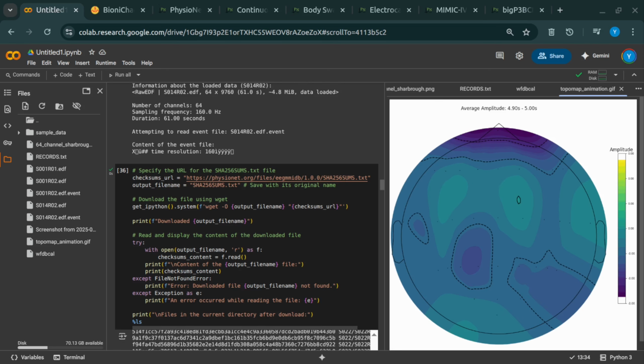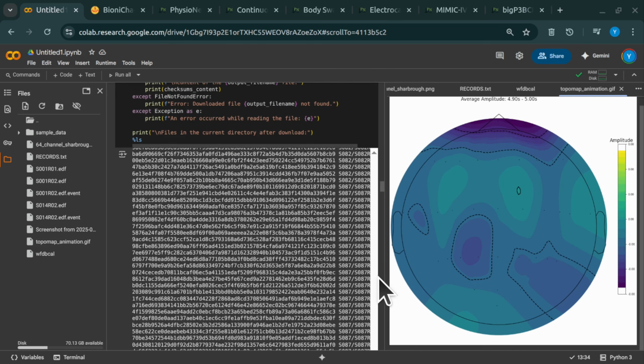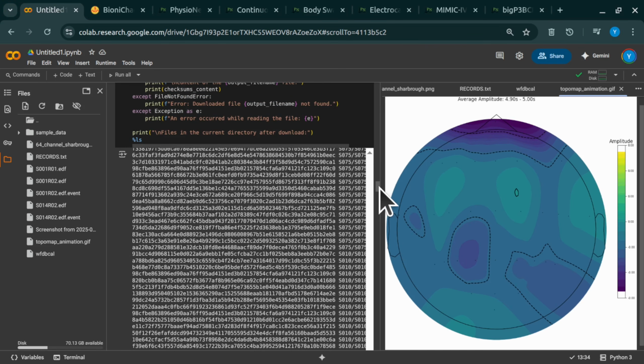Uh-oh. So what do you do then? Data forensics, pretty much. We tried opening it as plain text, looking at the raw binary data, just hunting for patterns, any clues. And did you find anything? We found hints. There was definitely a readable text header at the very beginning, but then it just turned into what looked like, well, binary code. Gibberish? Sort of. We started seeing potential patterns, though, like maybe the last 8 bytes of each chunk represented a time and an event ID. It felt like cracking a code, but we didn't have the cipher key. It was pretty frustrating. I can imagine.